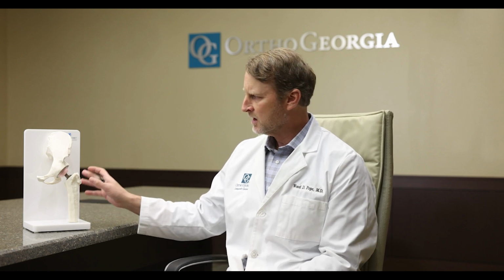And this model here is a modern day hip replacement. The surgery itself is typically about an hour long, and there are two types of anesthesia that you may receive. One is a general anesthetic. The other is a spinal anesthetic. The spinal typically numbs you from the waist down, and you are sedated so that you don't recall any of the whereabouts of the operating room, but you don't feel anything below the waist, so we're able to perform the surgery without any pain.